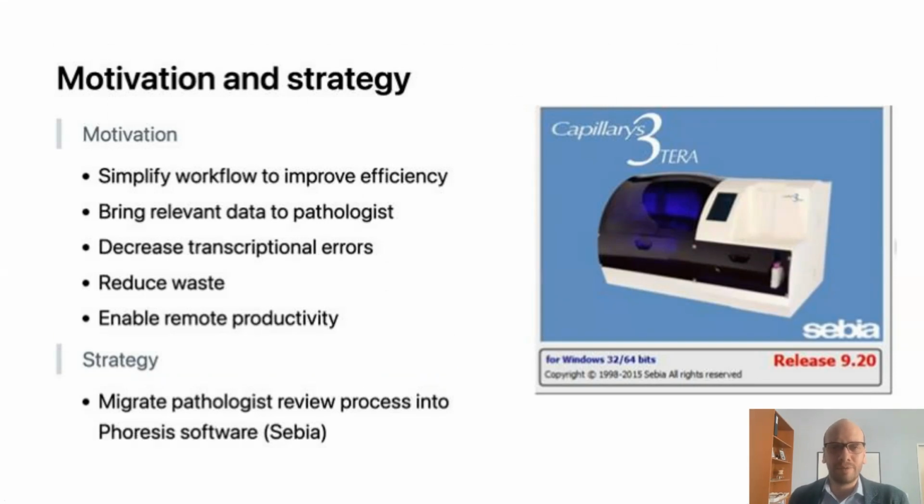So our motivation was to simplify the workflow to improve efficiency. We also wanted to be able to bring the relevant data to the pathologist so they could still be informed when they're interpreting the studies. We wanted to decrease transcriptional errors that are known to be associated with manual transcription steps in the laboratory. We wanted to reduce our waste trail. And as we went through COVID and the unpredictability of staffing, we wanted to be able to enable remote productivity to disaster-proof ourselves in a way.